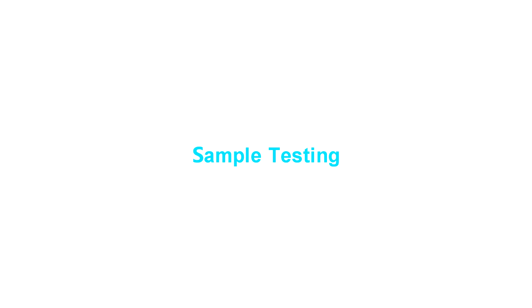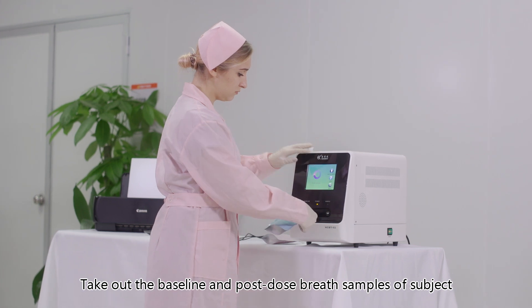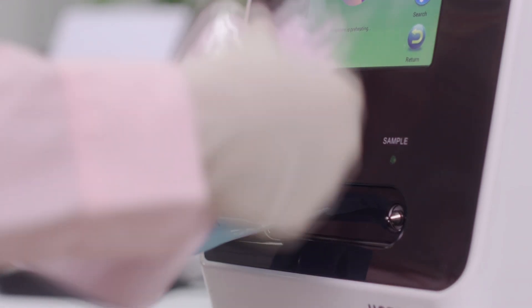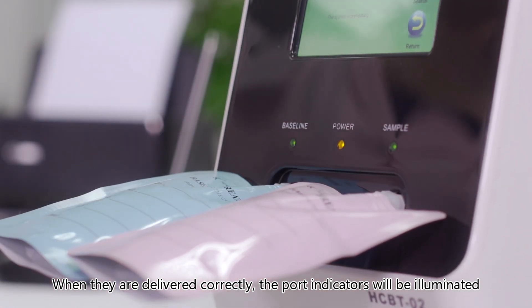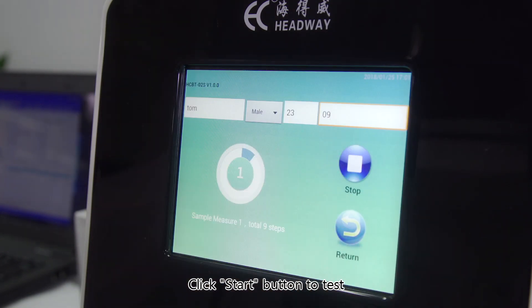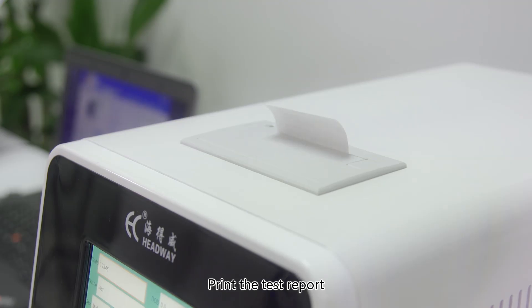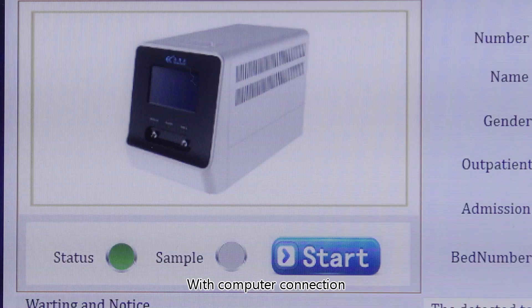Sample testing: take out the baseline and post-dose breath samples and connect them to the appropriate ports. When delivered correctly, the port indicators will be illuminated. Fill in the subject's information and click the start button to test. Test results will be automatically saved when the test completes. Print the test reports with a computer connection.